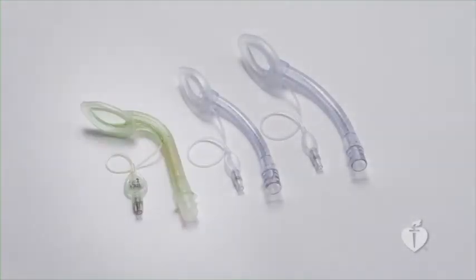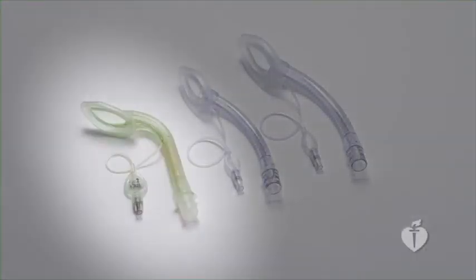Many of these airways can be inserted with the mask opening facing either the tongue or the roof of the mouth. If the airway has a rigid curve, it must be inserted with the opening of the mask facing the patient's tongue. If the device is inserted with the opening of the mask facing the roof of the mouth, you'll need to rotate the mask opening to face the tongue when the mask reaches the back of the pharynx.